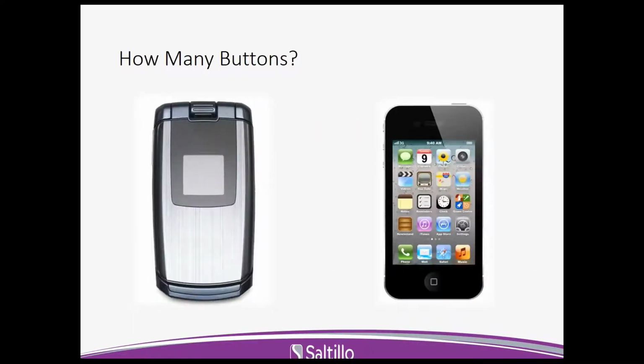When we're thinking about how many buttons, it's important to keep in mind that fewer buttons may actually be more difficult. Let's take a look. Does anyone have a flip phone with them or still use a flip phone? When we talk about the number of buttons on the screen, people often say to me, I want as few buttons as possible as I'm introducing a vocabulary file to a child. With AAC in general, there's this idea that fewer buttons is easier for them. But both Saltillo and PRC know that this is generally not the case.